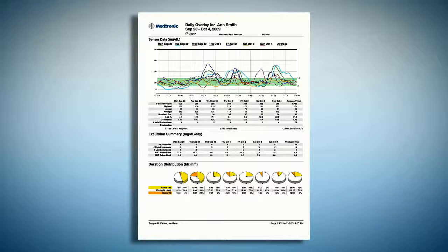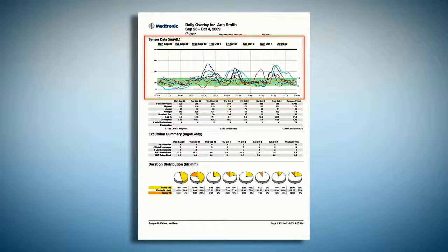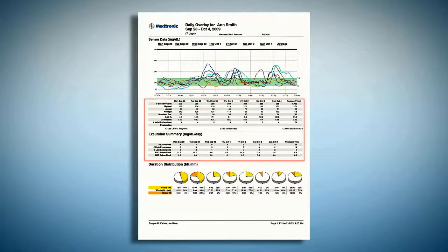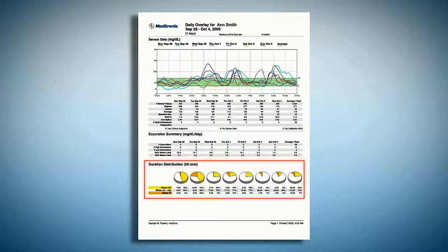The report is opened in PDF format for quick upload to electronic medical record systems. The Daily Overlay report provides an overlay of the sensor tracings from each day of the evaluation, making it easier to see patterns occurring around the same time each day. This report also provides daily statistical information, including an excursion summary of highs and lows, and pie charts of the duration distribution — showing what percent of each day the patient spent above, below, and within the target range.